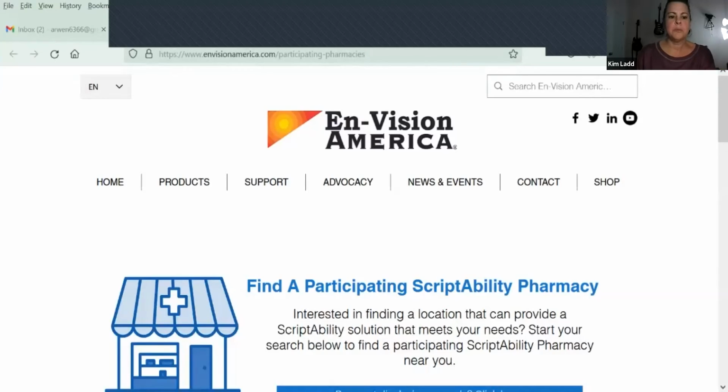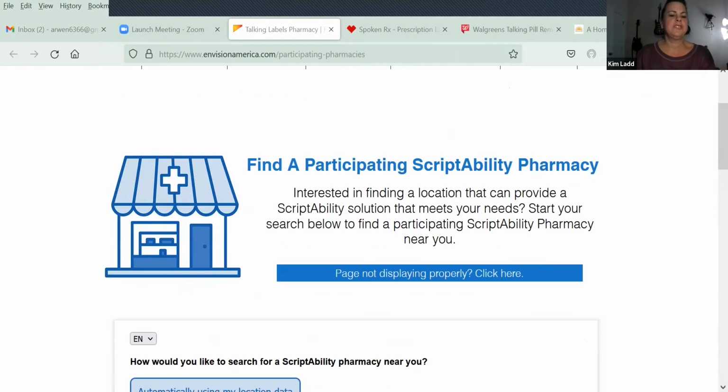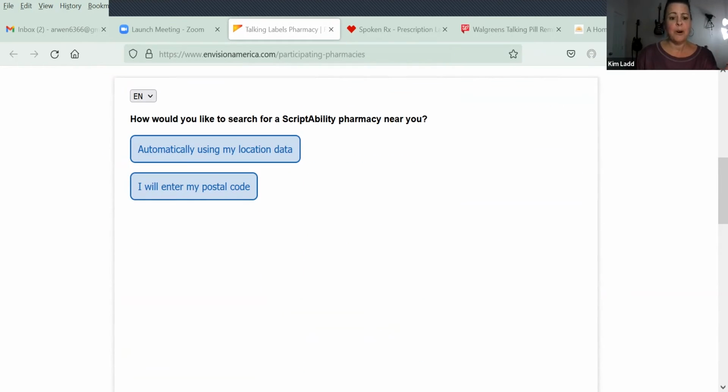So one of the things mentioned in the video, one of the things I said, you do have to go to a participating pharmacy. So let me share my screen again, and we will go to the Envision America website, and I'll kind of show you what I mean. Let me make sure I have the correct website up here before I switch. Share screen. All right. So, you can just type in Envision America, but it's envisionamerica.com. And it tells you all about the company and the ScriptTalk. And the page that I'm on says, find a participating ScriptAbility pharmacy. So you can either click the button that says automatically using my location, or I will enter my postal code.